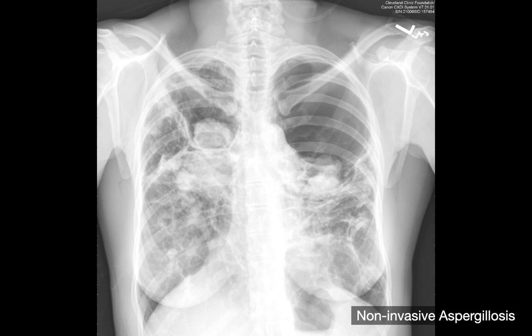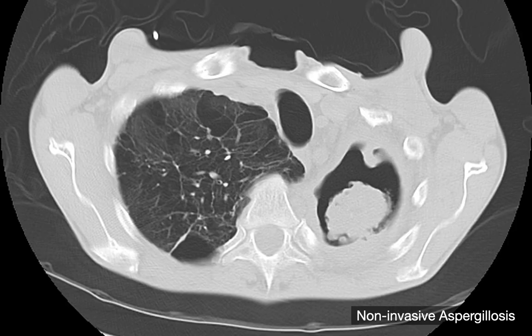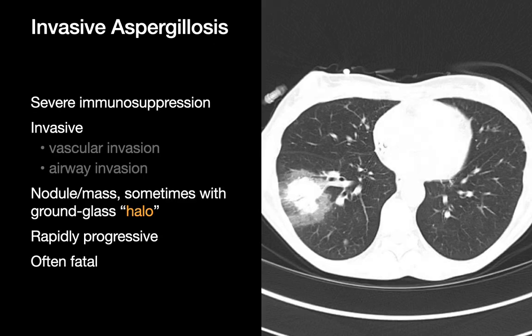When we see a mass like this sitting within a cavity, this goes by the term Monod sign in some literature. Invasive aspergillus is a different morphology of aspergillus infection that happens in folks who are very immunosuppressed. In this case, we're not talking about fungus setting up shop within a cavity, but just fungus growing de novo within previously normal parenchyma and not being controlled because the immune system is too weak — the fungus can grow quite aggressively, invading and disregarding vascular margins, airway margins, hence the term invasive.